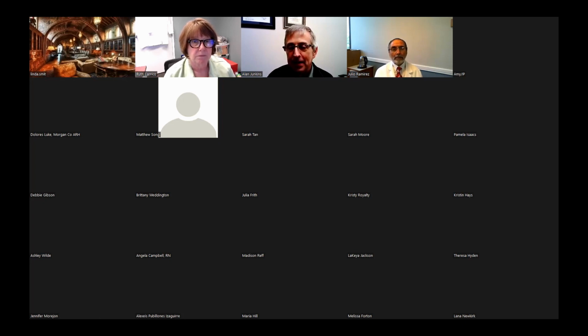So I think there's a lot of arguments to say what docs look at is the interpretation. What they need to know is the interpretation. If there is a need to know the MIC, then we might be able to do additional testing to get that. But we decided, I like the MIC, I'm going to stick with it. So we report the MIC and the interpretation both.